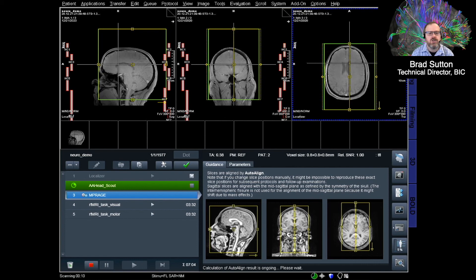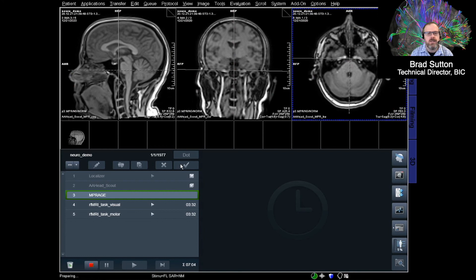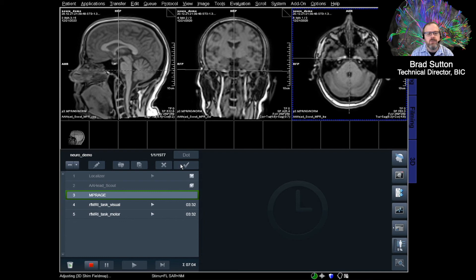The third scan, highlighted in blue, is a structural scan. This provides a really high-resolution scan of the brain's structure with good contrast — lights and darks that reveal the brain's anatomy. This scan gives approximately 0.8 by 0.8 by 0.8 millimeter spatial resolution throughout the entire brain. Getting a really good structural scan like this takes a while — about six minutes for this scan to run.